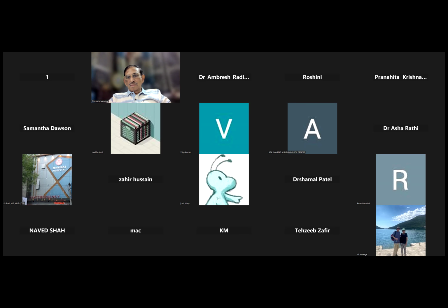Do we count all digits as a part of anomaly scan? I think Pranada will be the ideal person to answer because it's always pattern recognition. If there is polydactyly, you instantly will know that there is a wide thing. Then you start counting. Otherwise, it's really not necessary to count the fingers. Usually, many leading scan centers report that the counting of the digits was not done. They mention it clearly under the limbs. So it is not mandatory that digits should be counted.